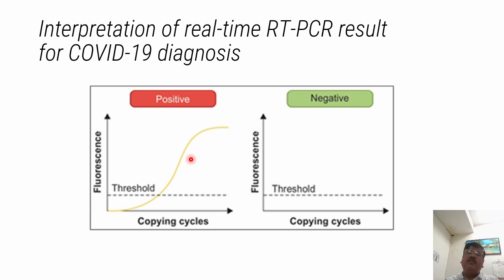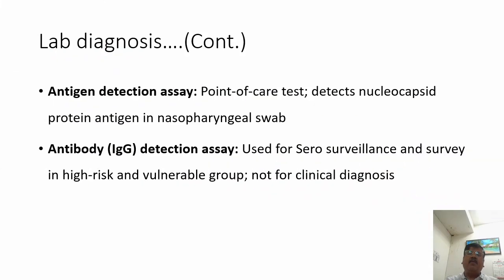If the cycle threshold is 45, that means 45 cycles are required for achieving a detectable level of gene. That means it is having a higher cycle threshold, so the viral load is less. Each kit will give some interpretation criteria, what should be considered as the CT value, and depending upon that, the report is given. All these reports can be documented and stored in the computer for further reference, in case there is some discrepancy or some problem, we can refer. So that data can be saved in the computer.